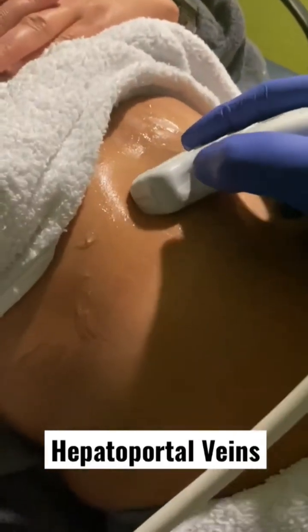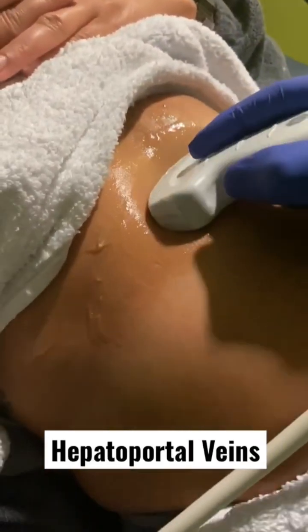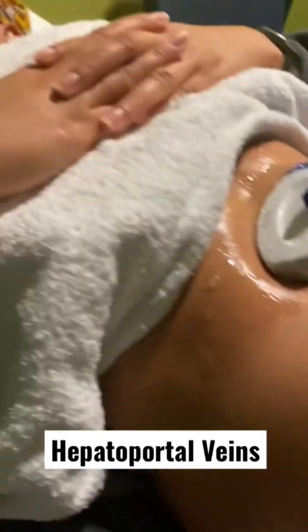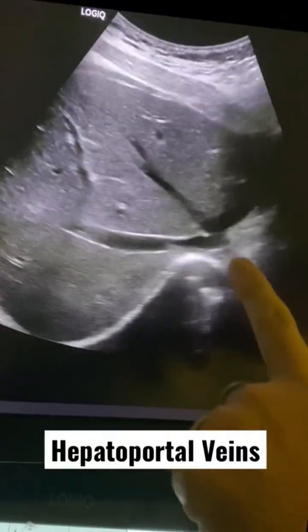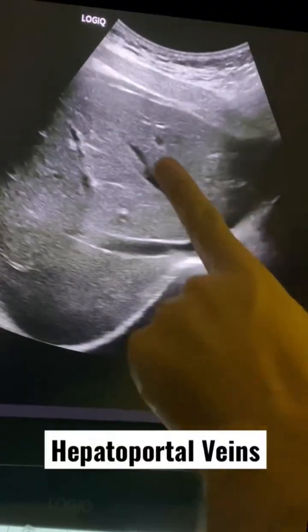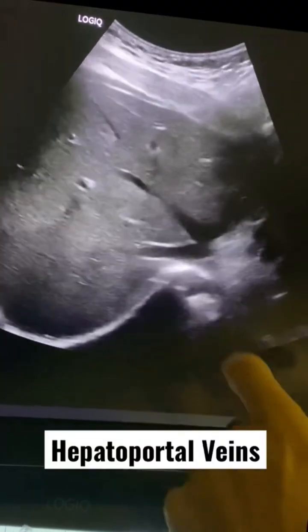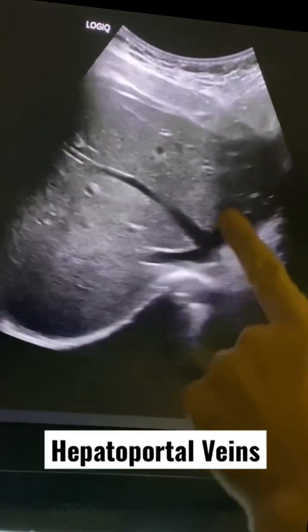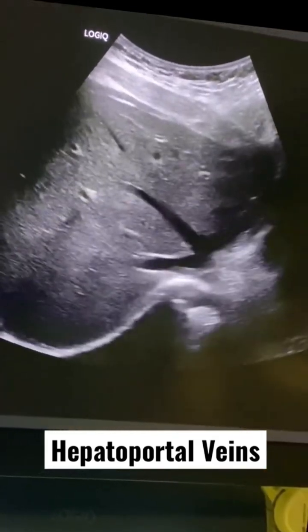In a lot of people, to get the hepatic veins you go right here to the epigastric region, and in this case you have to angle like this in order to get them. So right here we have the IVC, middle hepatic vein, right hepatic vein, and then the left hepatic vein is right there.